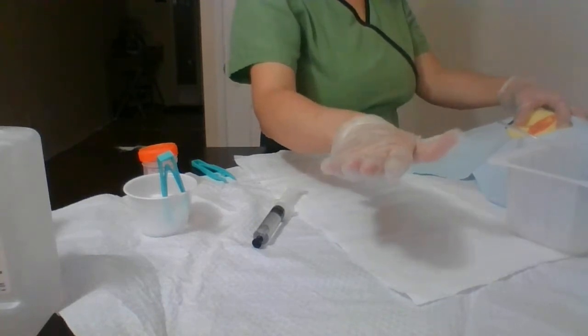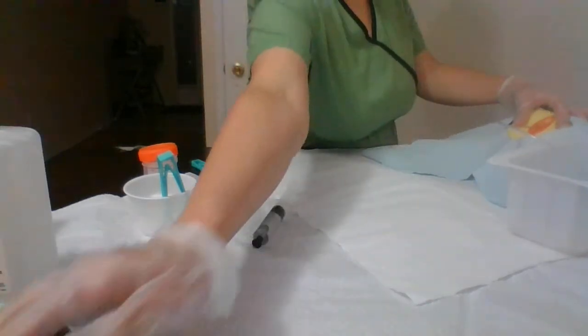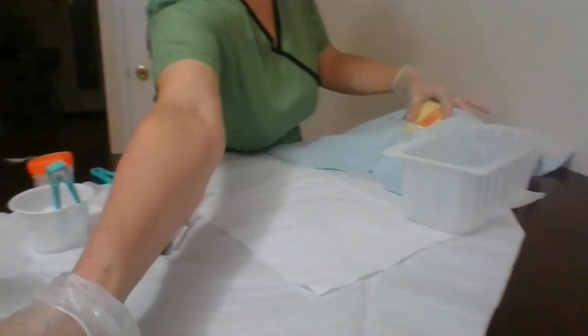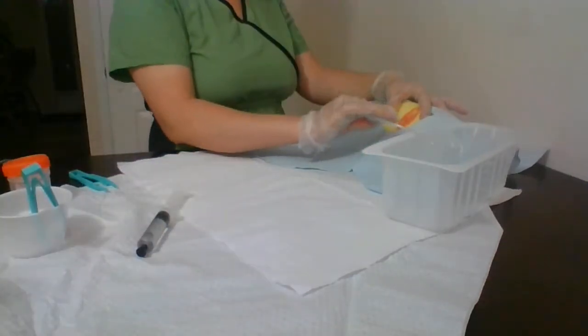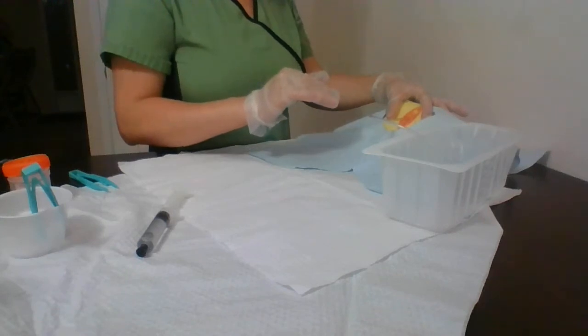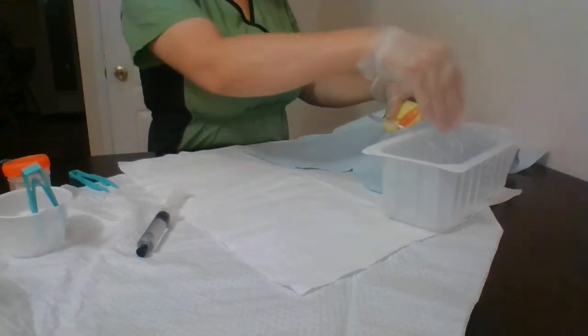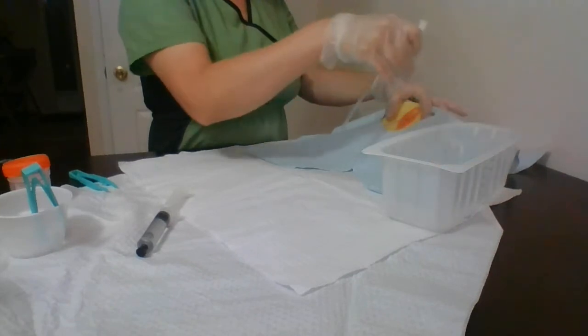I know that I'm not supposed to touch anything with my sterile glove. Okay, I can see that the drain has stopped. So now I'll quickly remove the catheter.